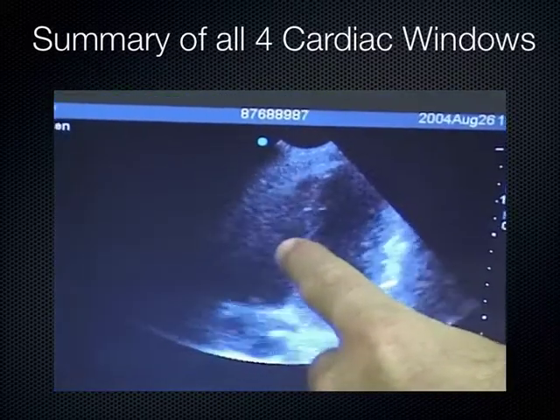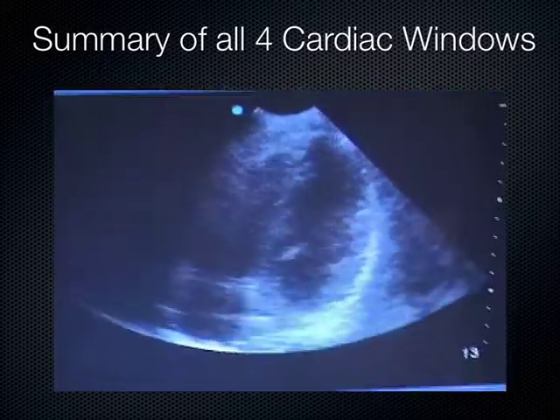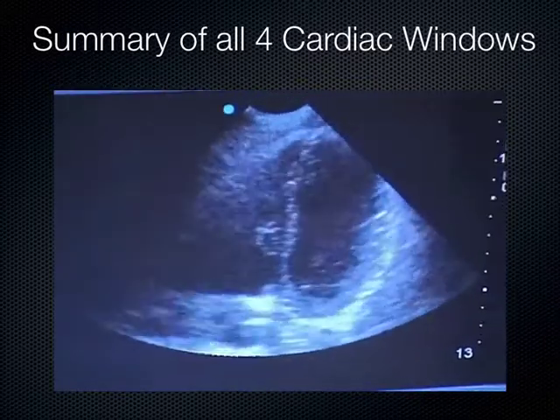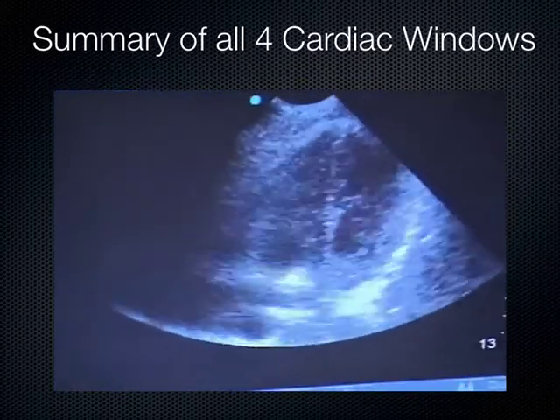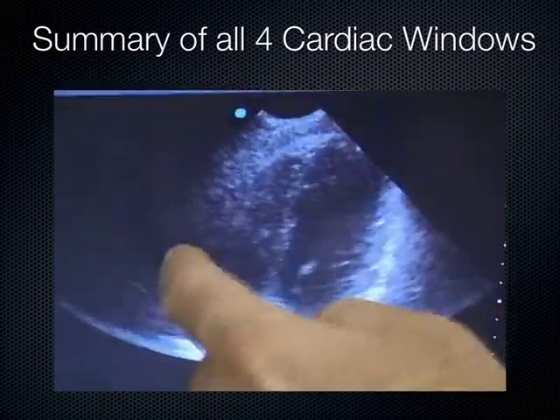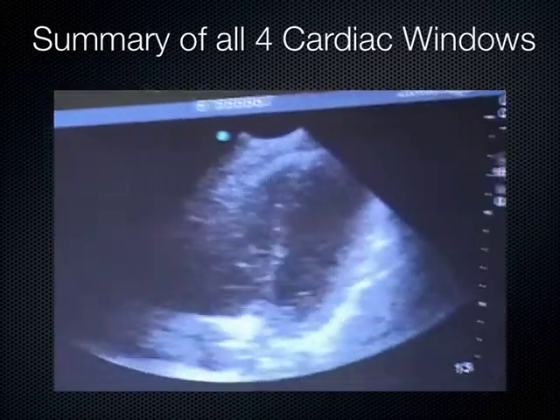When that right ventricle gets really big and approaches the size or even bigger than the left ventricle on an apical view, that's considered right ventricular strain and is suspicious in the right setting for pulmonary embolism. So that's why this apical view can be very helpful. This is the pericardium around the outside of the right and left ventricles there. You can look for effusions this way.